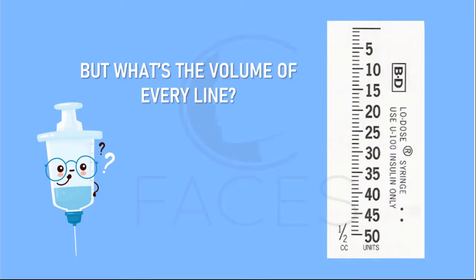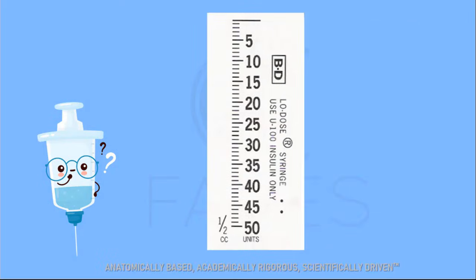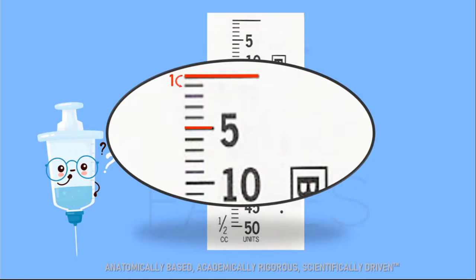To determine the volume at each line, or hash mark, we'll follow the same three steps I presented. To make it easier, let's magnify those lines to count. On this syringe, there are five lines between each numbered increment.